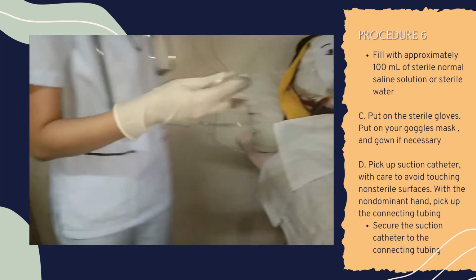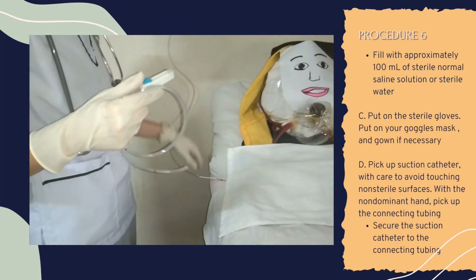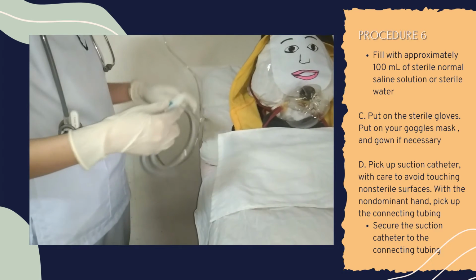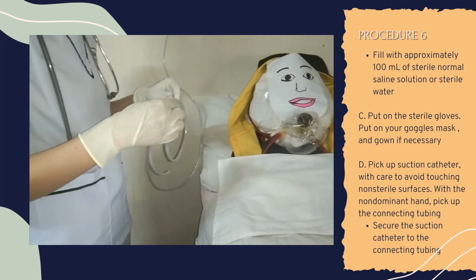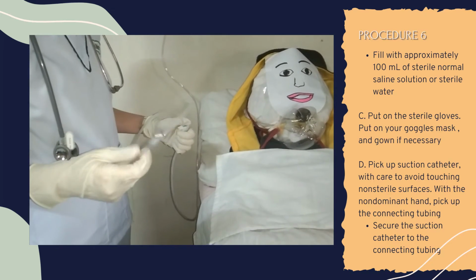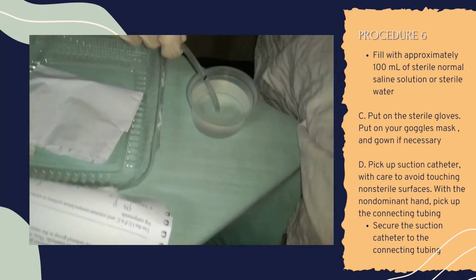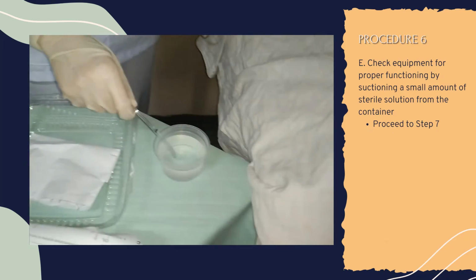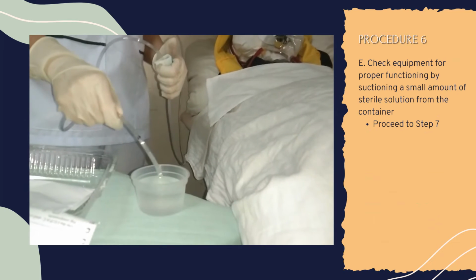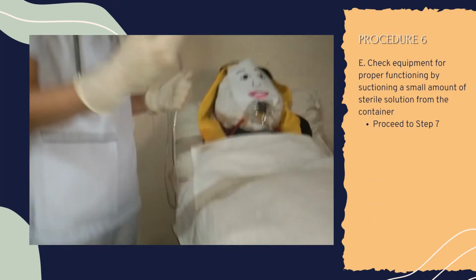Pick up suction catheter with care to avoid touching non-sterile surfaces. With the non-dominant hand, pick up the connecting tubing and secure the suction catheter to the connecting tubing. This maintains catheter sterility, and connects the suction catheter and connecting tubing. Check equipment for proper functioning by suctioning a small amount of sterile solution from the container. This ensures equipment function.